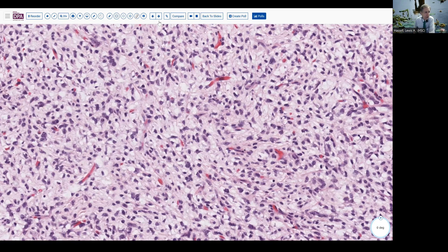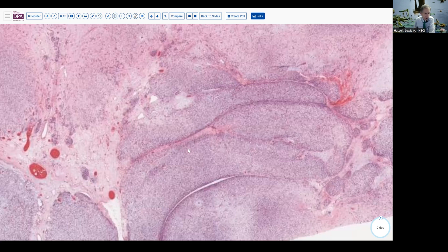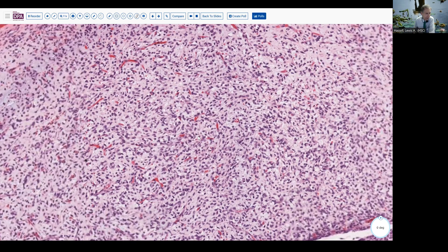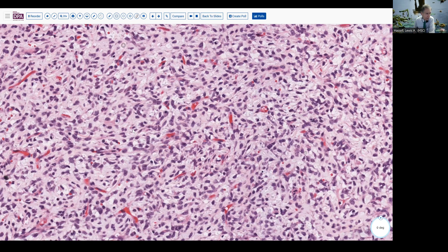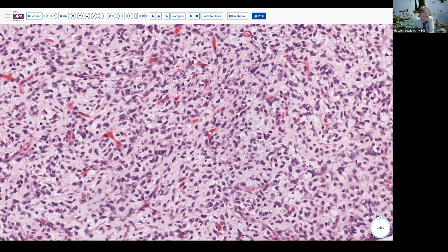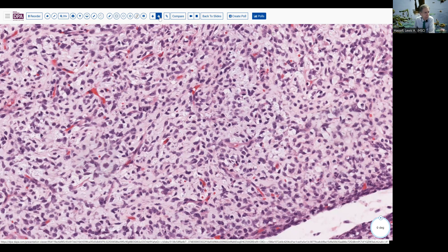It's important in these tumors to sample them fairly well. So I've included another digital slide section to allow us to look and compare some of the more cellular areas in this tumor as well. Again, we can appreciate the nodularity to this tumor, and as we come in, we can again see this nice vascular background to this lesion. CD34 might be useful in some settings to demonstrate or highlight this kind of vasculature. Here we're seeing maybe a little bit more suggestion of lipoblastic differentiation — here's kind of a multi-nucleate pattern cell. So for the classic histopathologists, I think there are certainly some strong features to suggest myxoid liposarcoma.